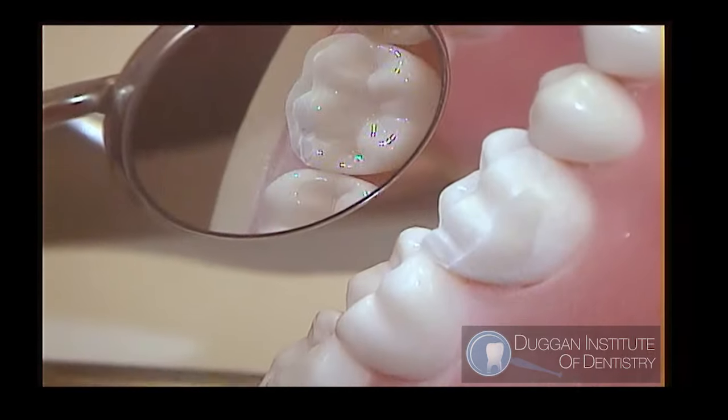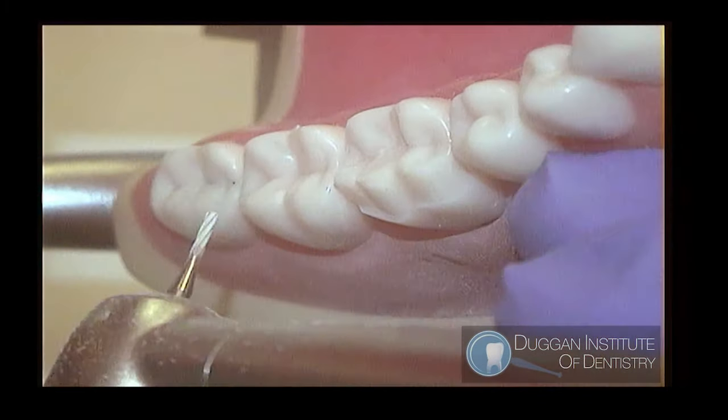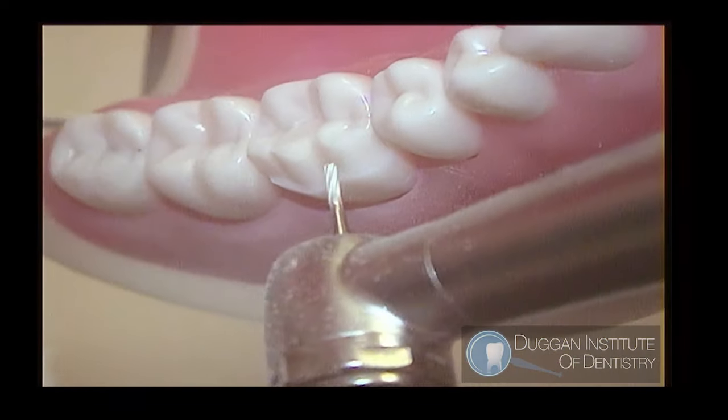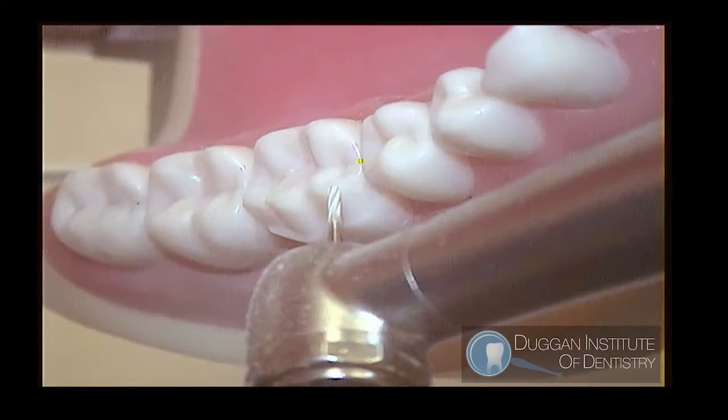Now we are ready to reduce the B-plane, the mesial buccal cusp. Take the angle from the matching adjacent cusp, keep the burr parallel to the ridge, point the burr and follow the central groove. Reduce half of the cusp at a time.